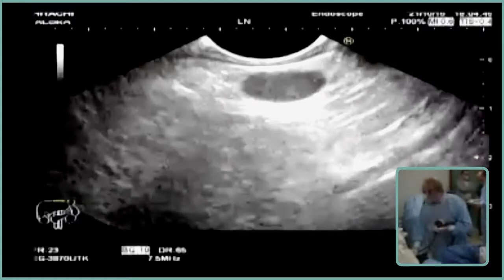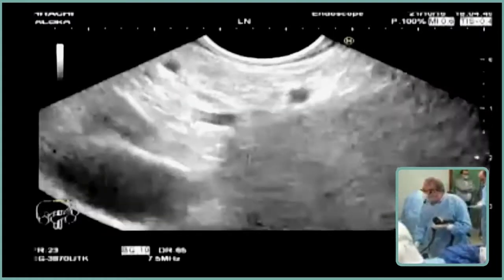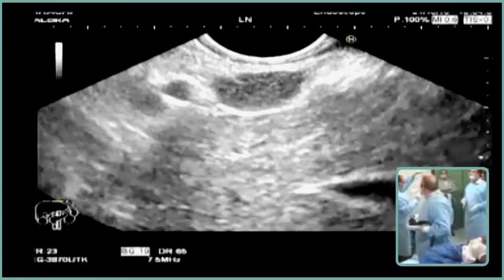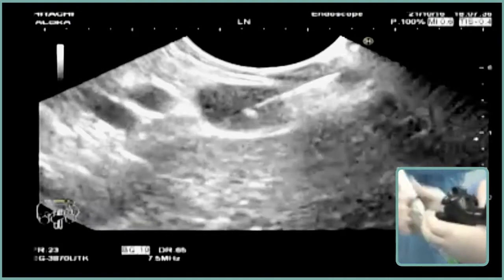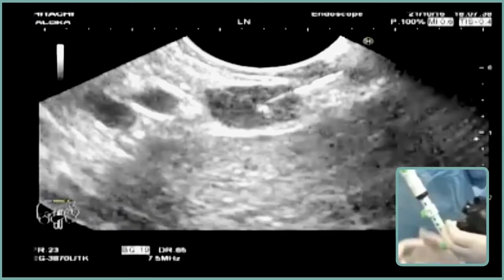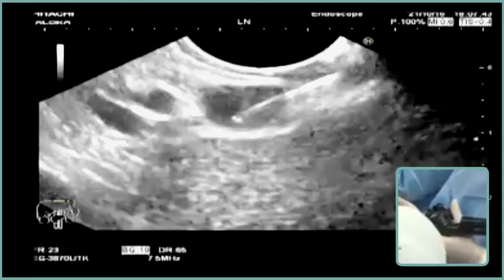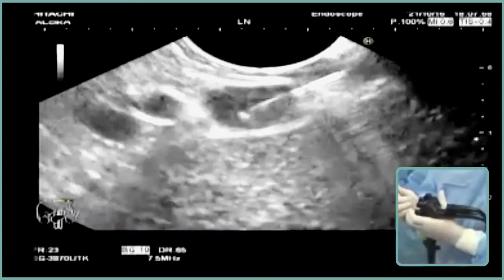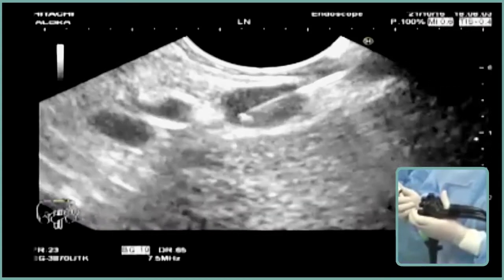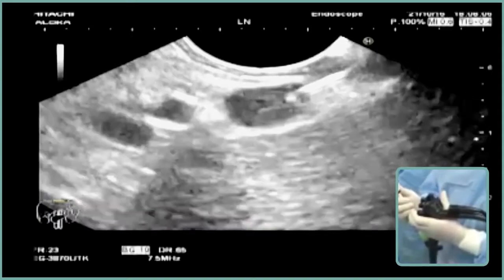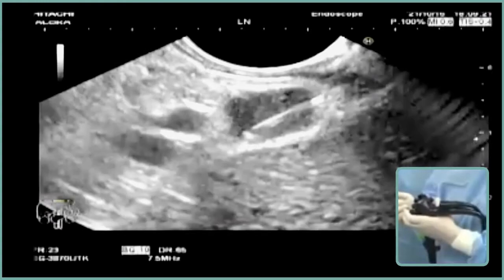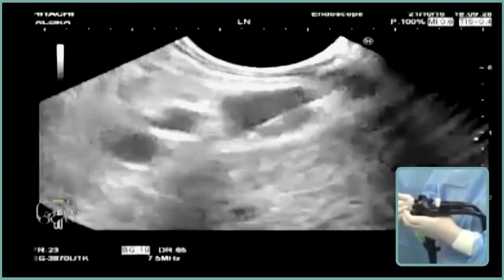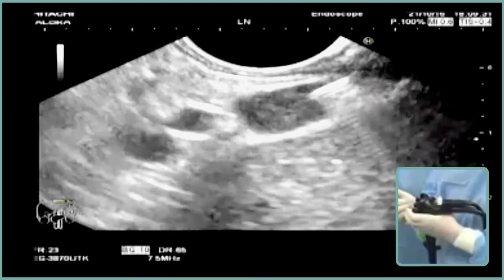This is also suspicious — but smaller. One rapid — I am now inside. You see the door-knocking technique — one shot. Why? Because the lymph node from the stomach approach is very difficult — because it is loose. I am now in the most lower aspect of the node, and the middle aspect. Now I am moving with the lever.